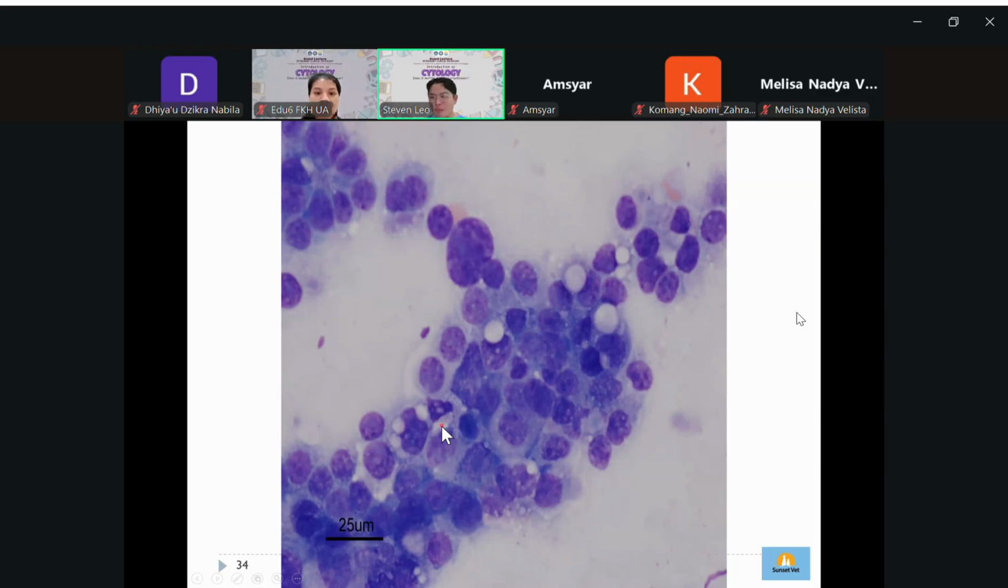Okay, from all of this, which one do you think? Let's think about the easy things. If it's cancer, you need to think about epithelial, mesenchymal, or round. Which one do you think? You can see them, and you need to think, is this round or is this wispy? Please help me answer that.